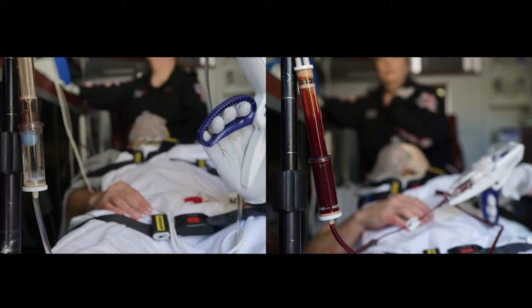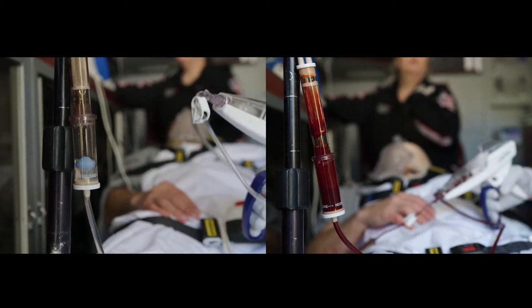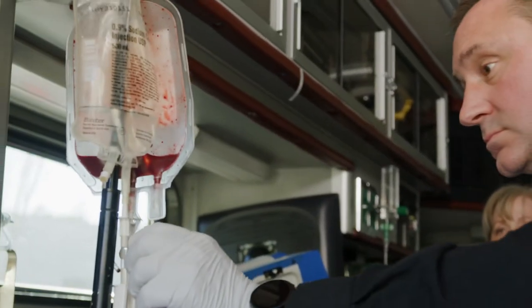The air check is designed to stop the flow of fluid if air inadvertently enters the system. Always stop infusing if the level of the air check ball starts to drop — this is an indicator that you're out of blood or fluid.